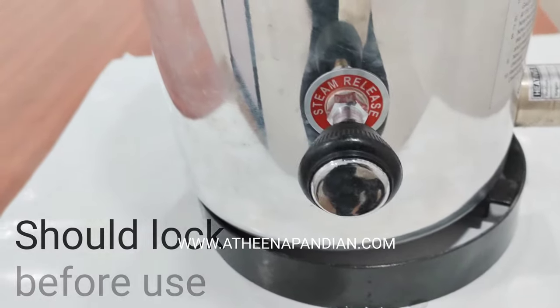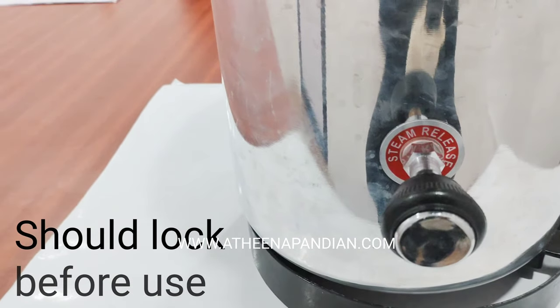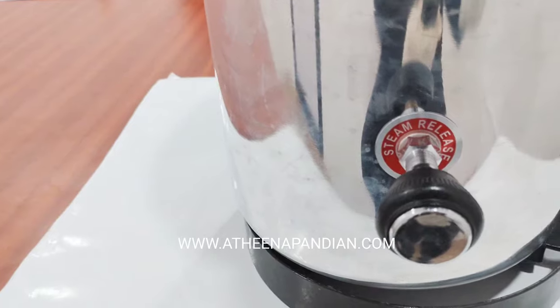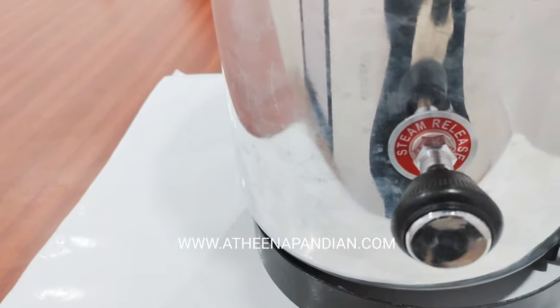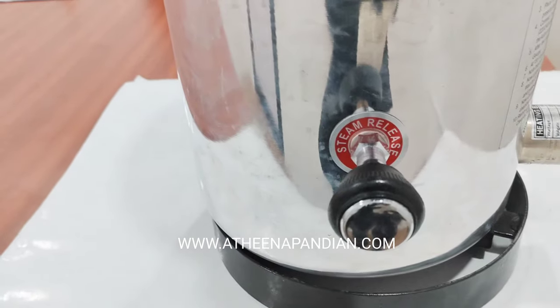Before the initialization process it is mandatory to lock the steam releaser, since when the process is going on the steam will be released from the steam releaser and no pressure will be maintained at the normal pressure range.